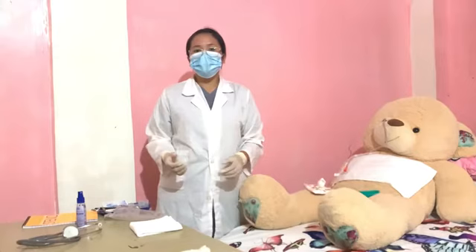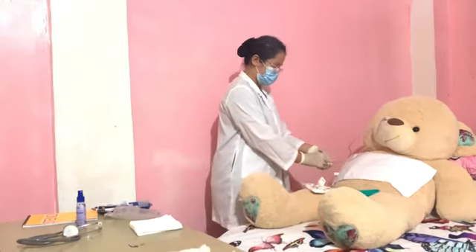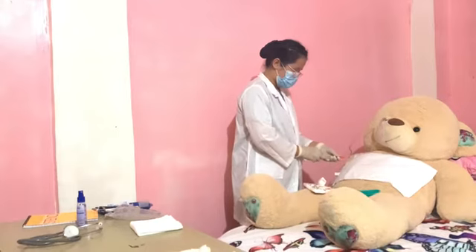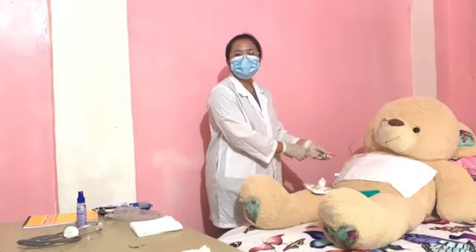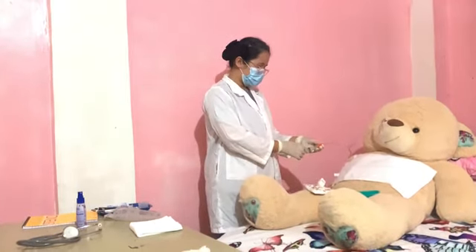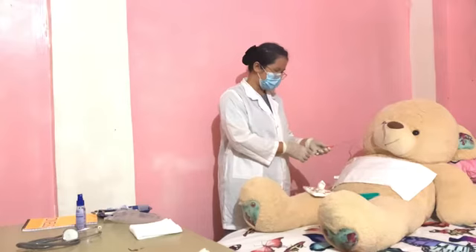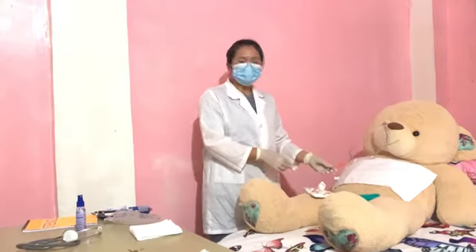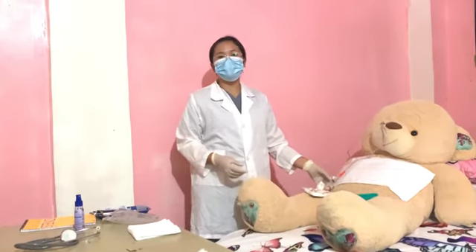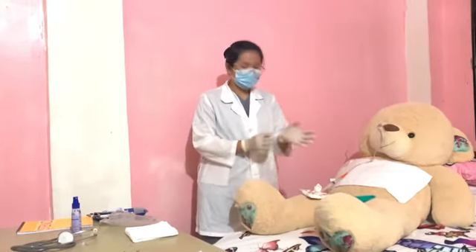And then, attach the aseptic syringe to the NG tube. And then after that, visualize the aspirated content, checking for color and consistency. So if we aspirated greenish color, then it is a good indication that it is placed correctly in the stomach. And then, obtain radiography, X-ray, of the placement of the tube based on the facility policy and as ordered by the physician. And then remove gloves.